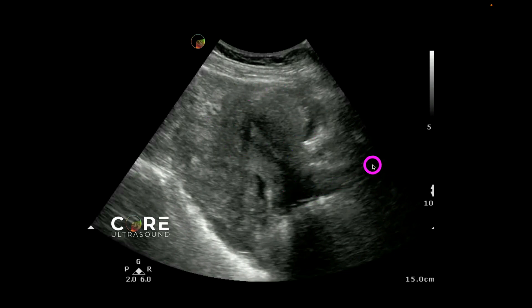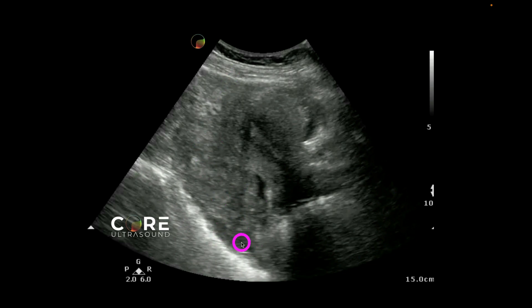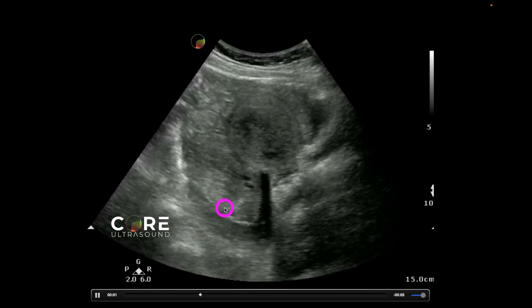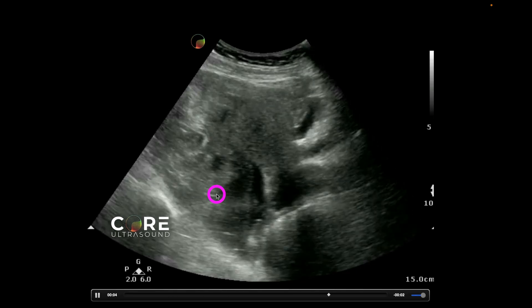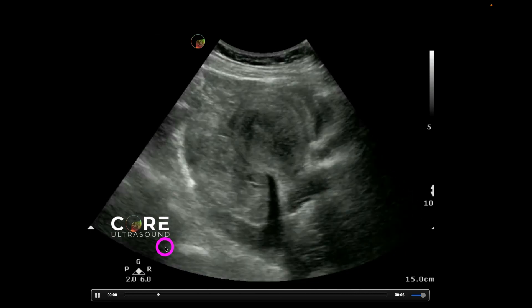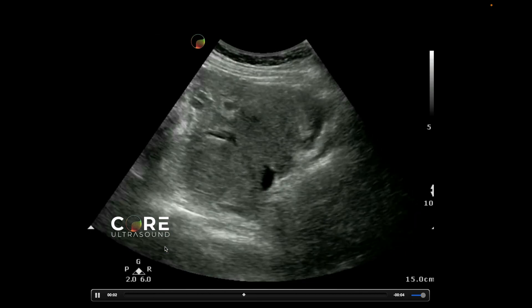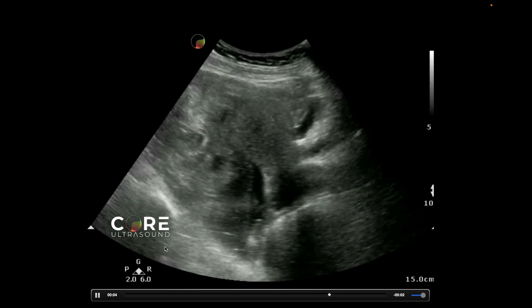We have the vaginal canal down here and a decompressed bladder likely over here. We can see a little bit of free fluid, but we're also seeing all of this — this is actually clotted blood. This is what clotted blood can look like, so be very careful not to mistake clotted blood for a normal finding or for intestines.